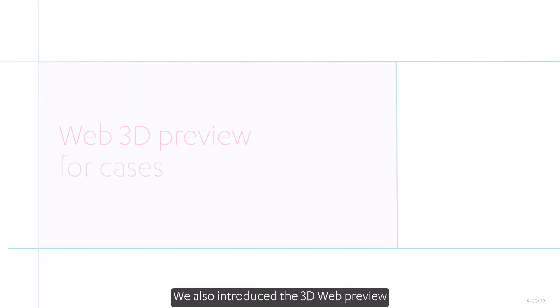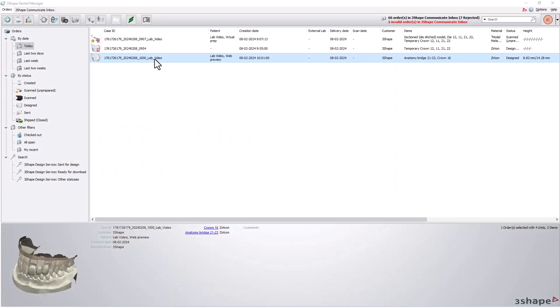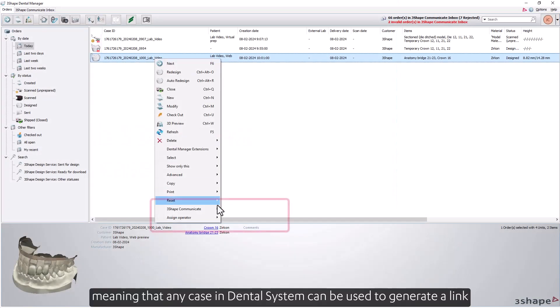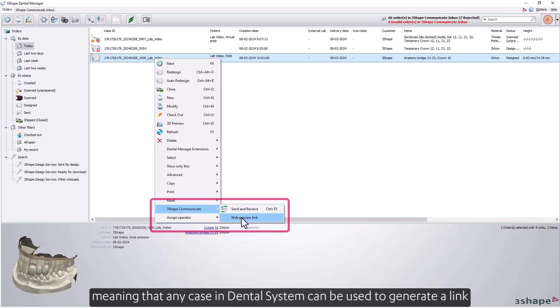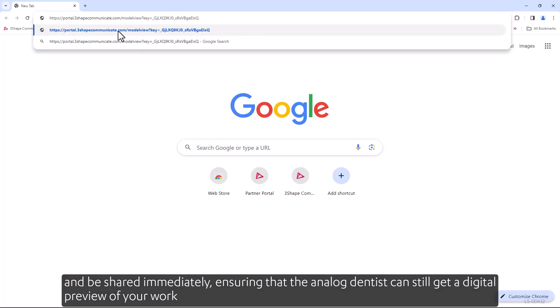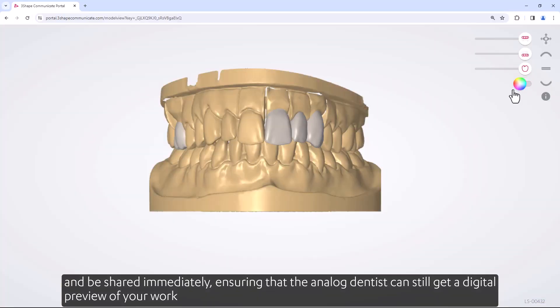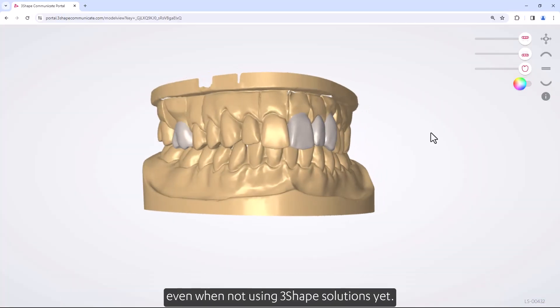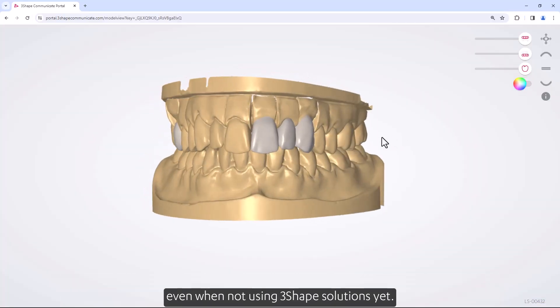We also introduced the 3D web preview, meaning that any case in Dental System can be used to generate a link and be shared immediately. This ensures that the analog dentist can still get a digital preview of your work, even when not yet using 3Shape solutions.